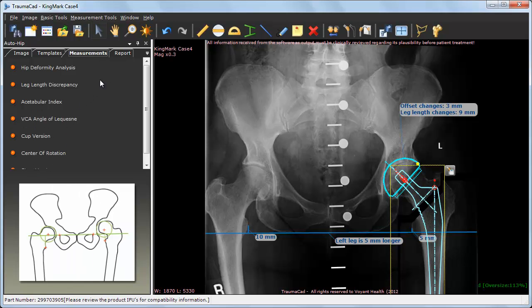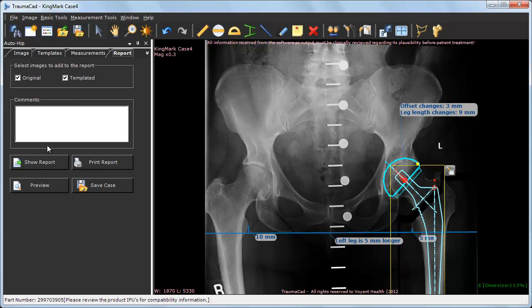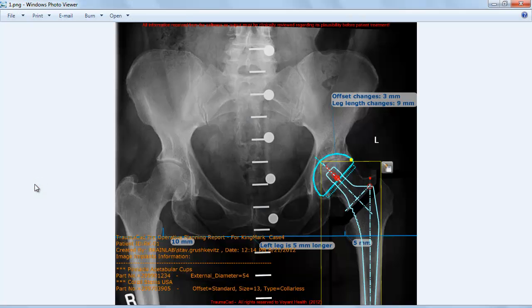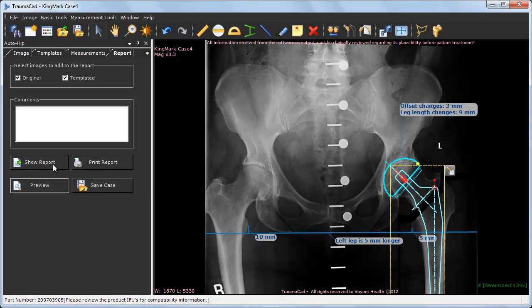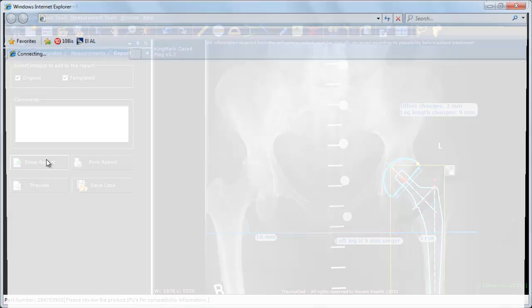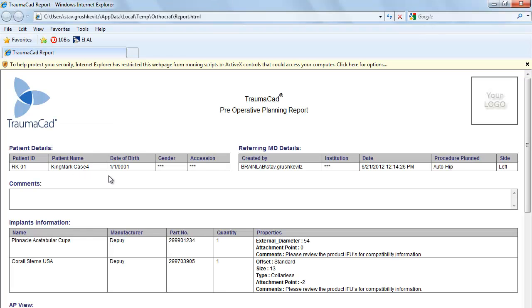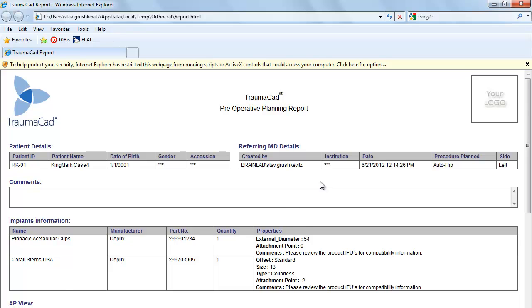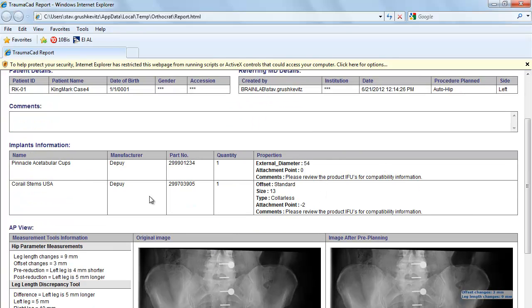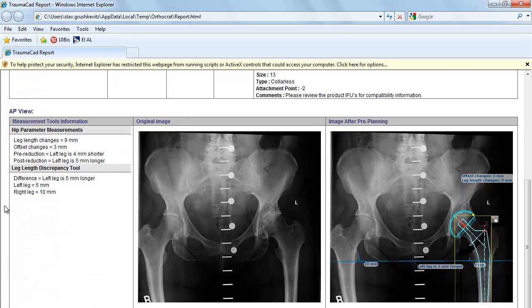Once you feel the planning is completed, you can go to the Report tab to preview the image that will be saved or committed back to the PACS system. A report is shown including the patient information, the selected implants information, any measurements taken, as well as the original and planned images.